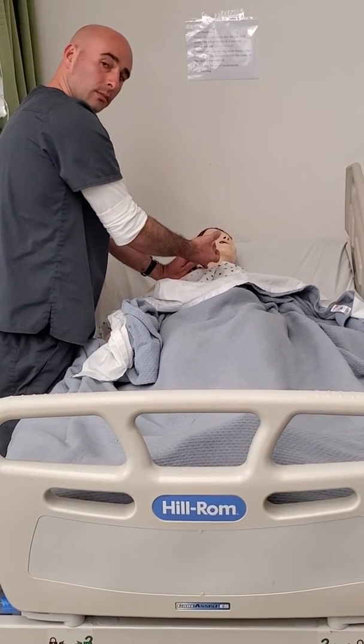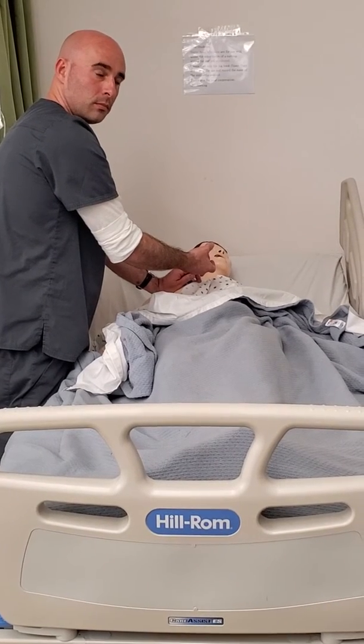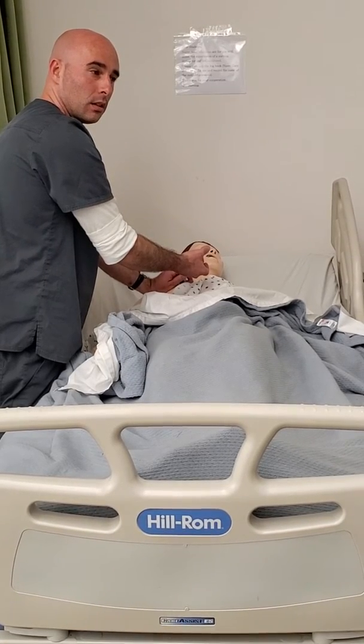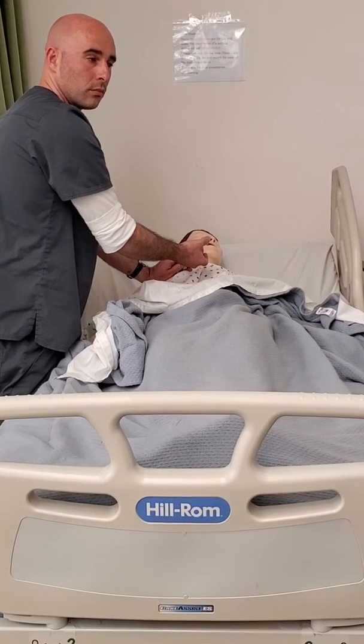You want it to swirl. So you were right with creating the turbulence. You want it to swirl, but within the line, not in the right atrium, because that would irritate the atrium. You're just trying to clean out that line and make sure no medication is sticking to the sides or any fibrinogens are building up. So that good flushing technique helps prevent the fibrin clot, fibrin sheath, or occlusions.